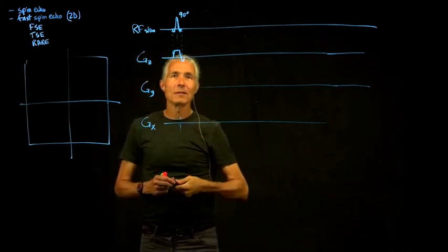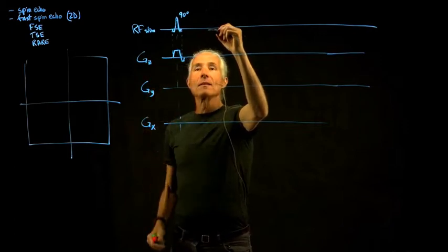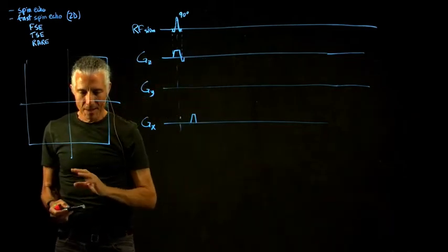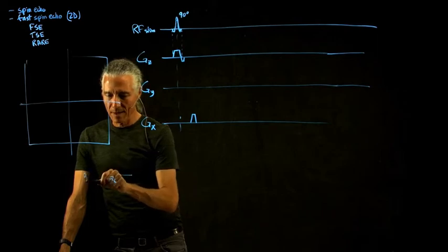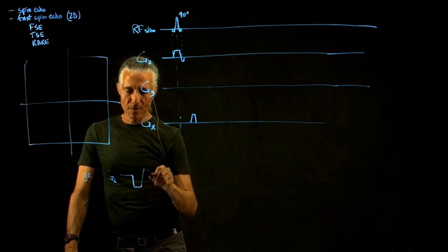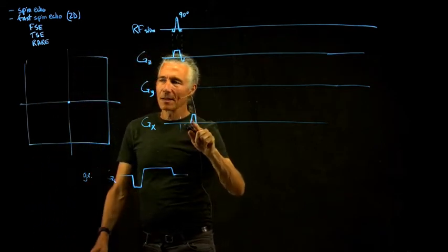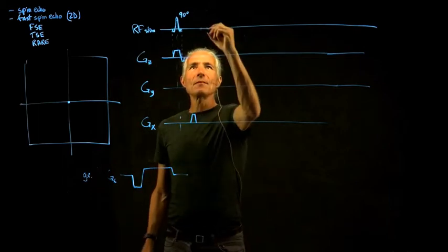So that's our slice select, and then we go to the right side of K-space. If you remember, I didn't say it last time, but when we were doing a gradient echo, for the readout we would typically first go to the left side of K-space and then go all the way to the right side of K-space. So like start in the middle, go here and then come back across. We're doing that here, but the reason that this one is positive is because there's a 180 coming up and the 180 flips things.